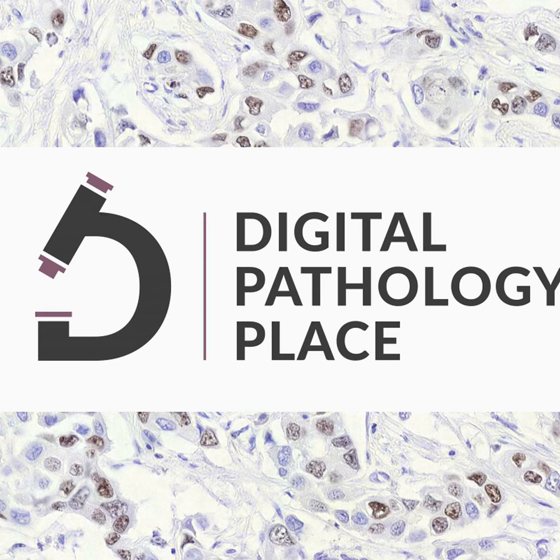So please check. I don't know if the assumption was that it should be identical. The digital pathology community is committed to DICOM, right? We want to have a standard for those images, because we want to ensure interoperability, and some first AI trainings with converted files did not result in systematically decreased performance. So if you train with these, everything should be okay, but just keep in mind that this is a different format, right?